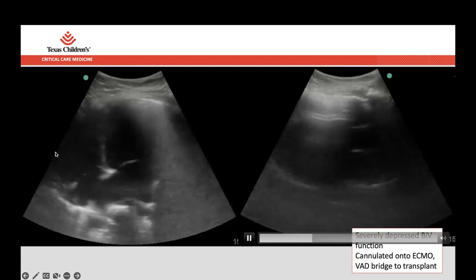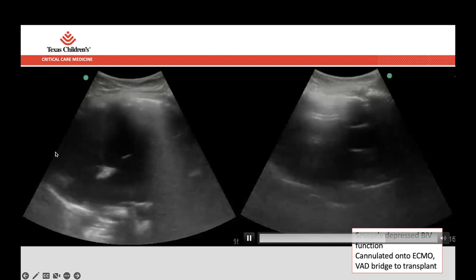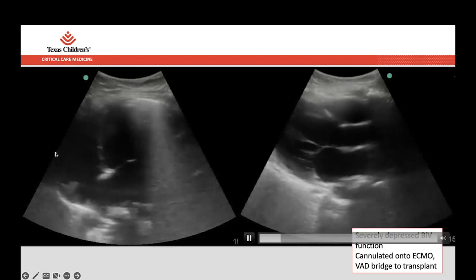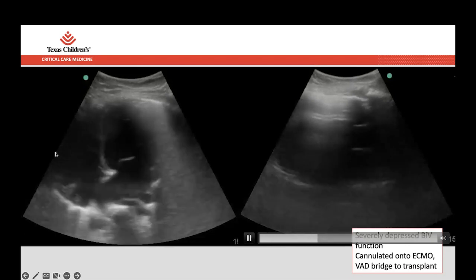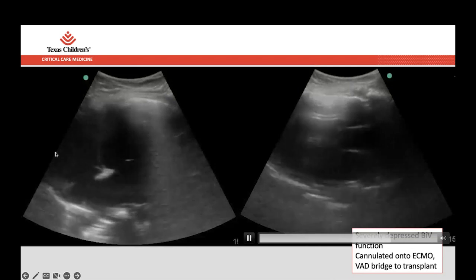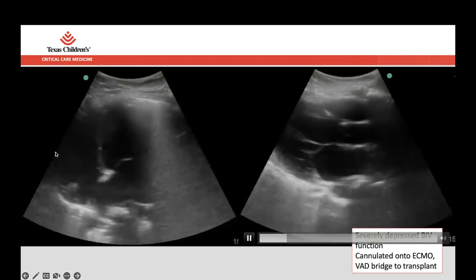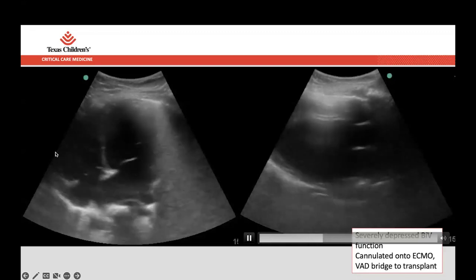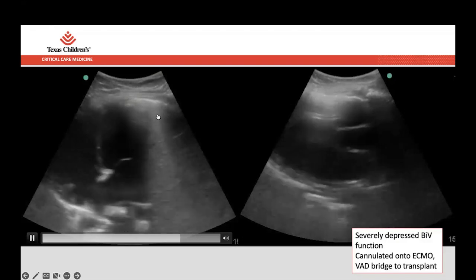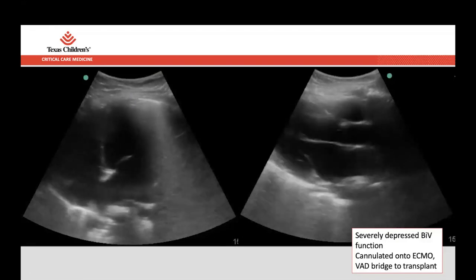But when you're in the throes of things, sometimes we can still get to the endpoint without necessarily having all the pieces that everyone wants, with the equipment that we have in front of us, as long as it can still do the job we need. In this case, this was just an example of using the curvilinear probe off of an OR machine to try to get a good image done.